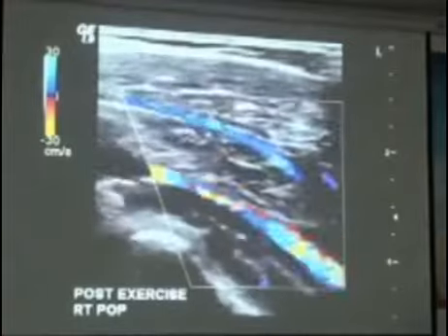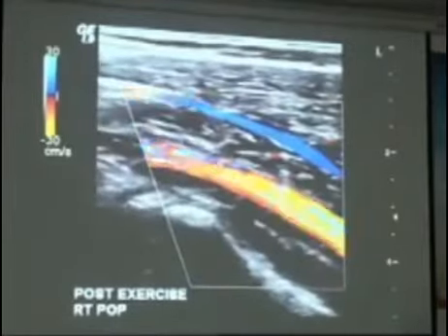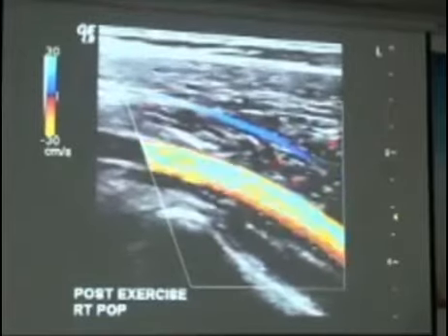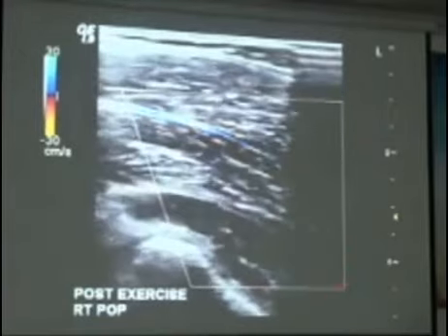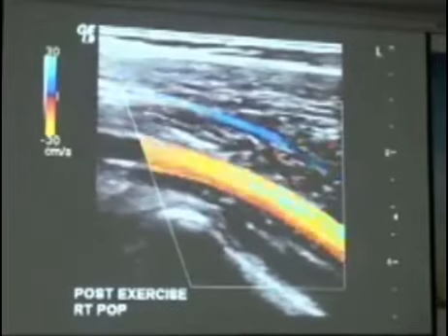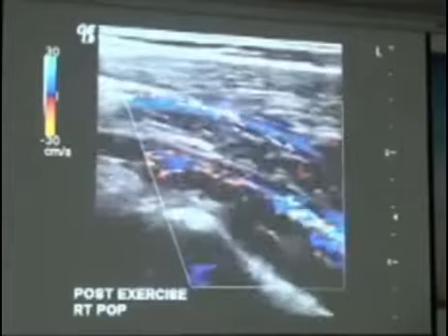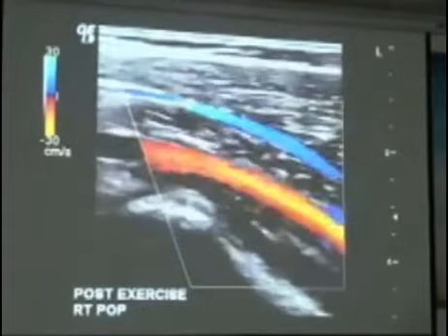So this is just another case. You can see it was a normal flow, and then the patient's on the tippy toes, and then they come back down. So normal up on their tippy toes, and then back down. So generally, this is due to hypertrophy of the medial gastroc or the proximal head of the medial gastroc muscle.